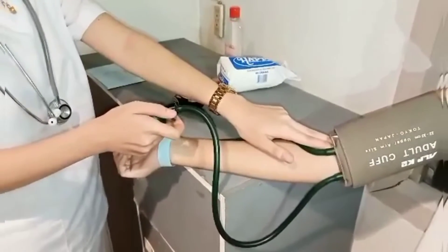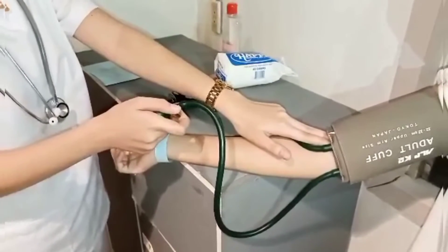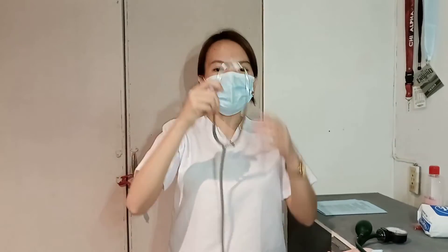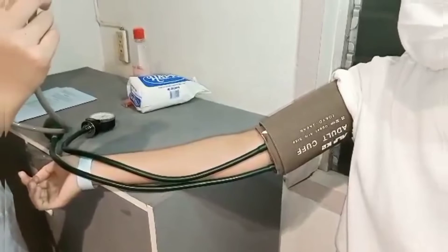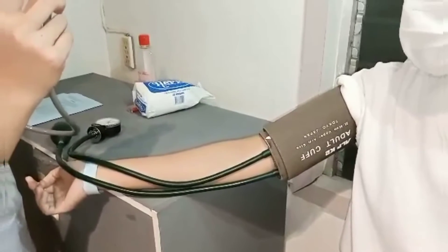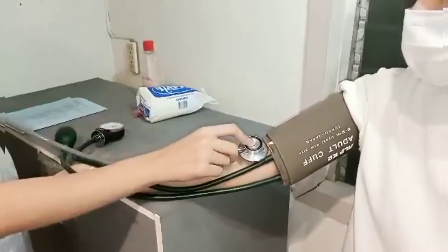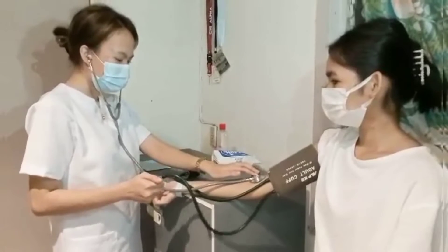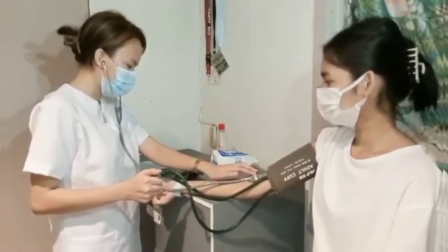Note the point on the gauge where the pulse disappears, deflate the pump, and wait for 15 seconds. Next, place the stethoscope ear pieces in the ears properly. Then position the diaphragm of the stethoscope firmly but with as little pressure as possible over the artery where the pulse is felt. Don't allow the stethoscope to touch clothing or the cuff. Pump the pressure 30 mmHg above the point at which the pulse disappeared.